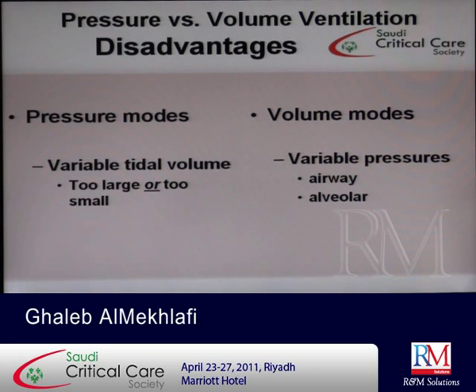So each one has advantages and disadvantages, and you have to choose according to the patient's lung mechanics. And this will be determined also by the ventilator. You can make a lot of calculations and testing on the ventilator and determine what is the best mode or what are the best parameters to be set for the patient.